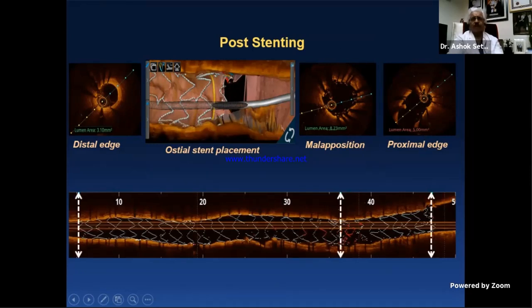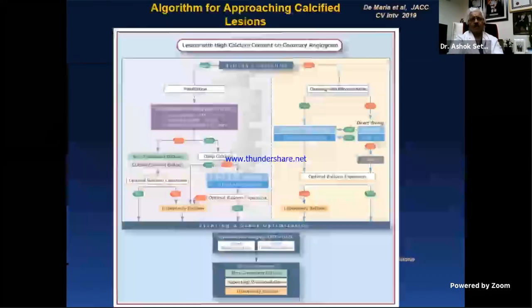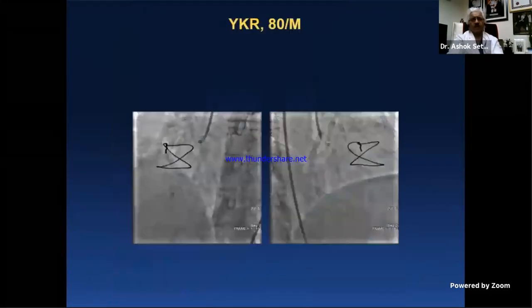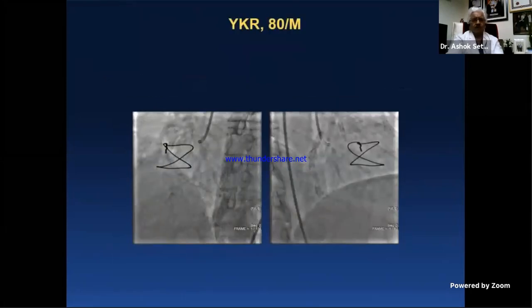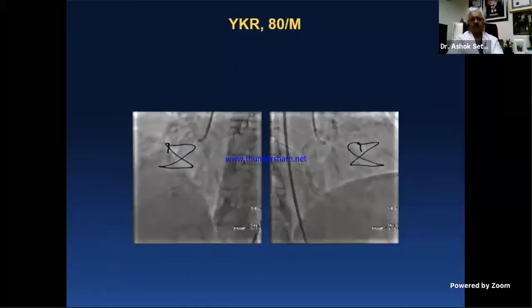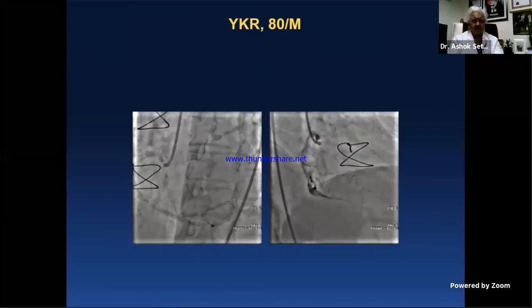But finally, one of the worst cases I'd like you to understand and how to combine things together is this, I think is this case, yeah. So if you just excuse me for this, and this perhaps represents to me the real combination why we call it Shepherd's crook. This has been intervened once.